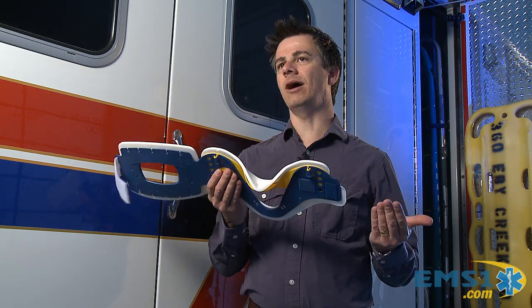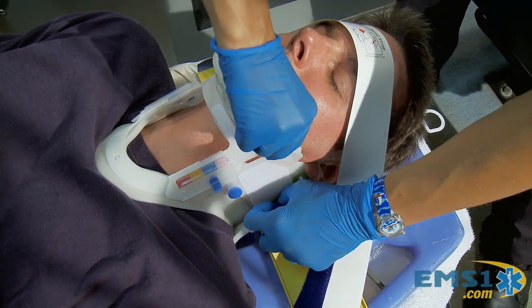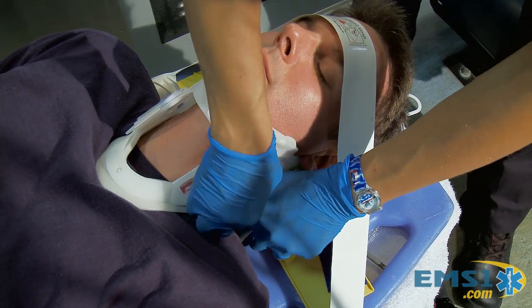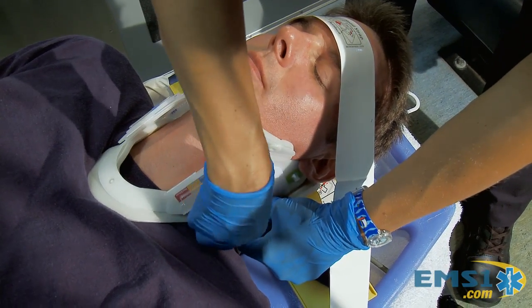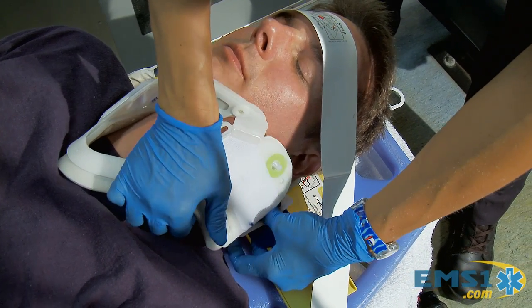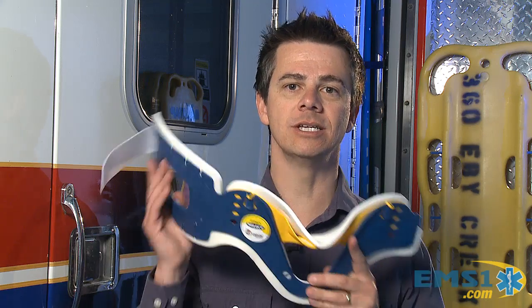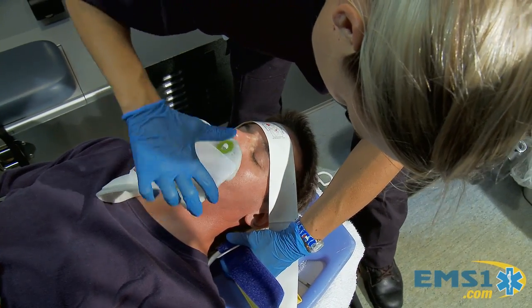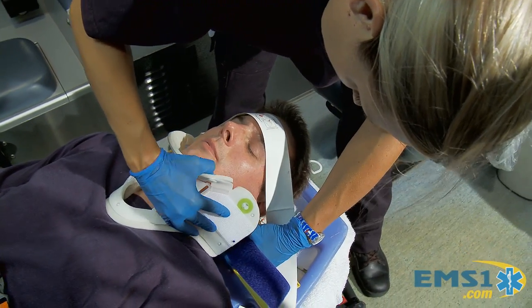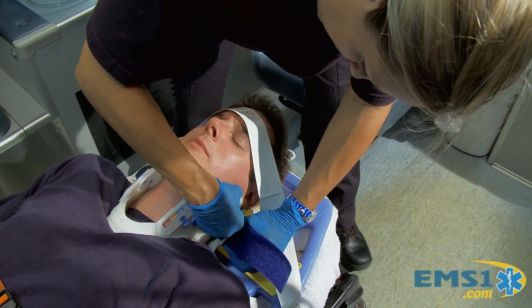But it also presents some problems and some perils for us. Most times, after you put it on, you can't see what's going on. You can't check for JVD. You can't see if a wound under the neck is getting worse or better after you've applied pressure to it. The risk really comes in when you open this up, because every time you open it up to check for JVD or check a wound, you have to reapply it, make sure that everything's in line, check the neuros, make sure that the patient can still feel and move everything. And it just becomes annoying.